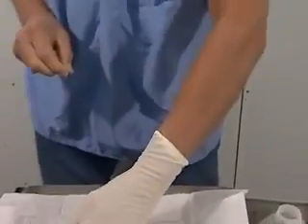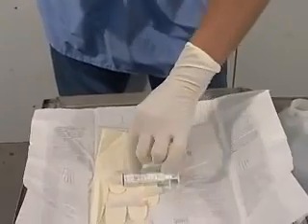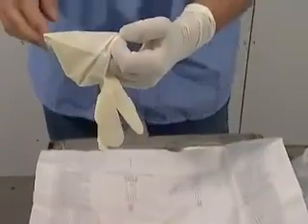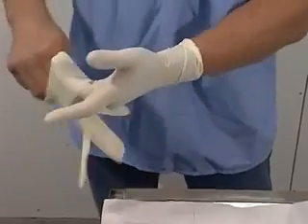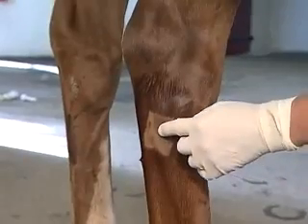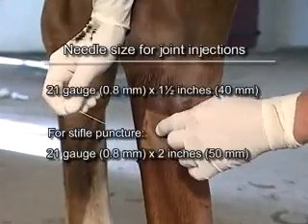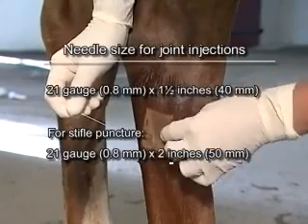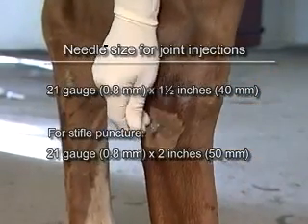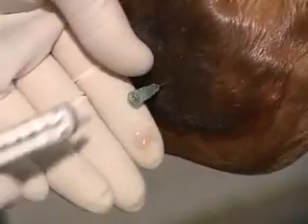If any sterile item or surface comes in contact with a non-sterile object or surface at any time during the procedures, it should immediately be changed or re-disinfected. A suitable needle size for joint injections is 21 gauge by 1.5 inches. For stifle puncture, the length should be 2 inches.